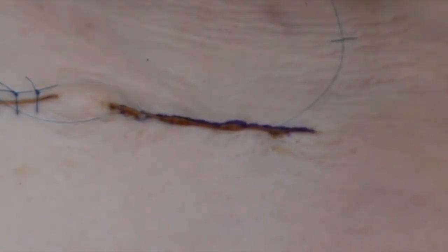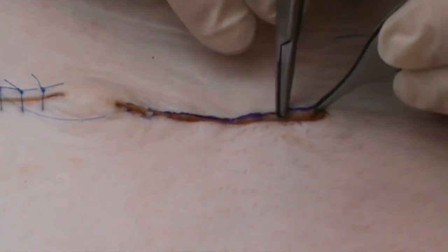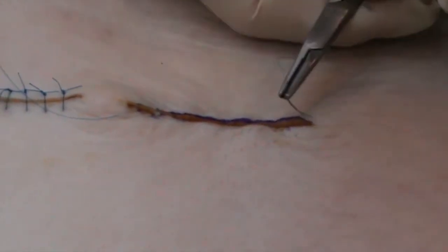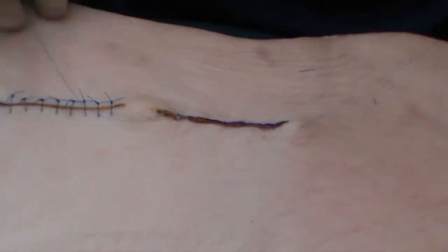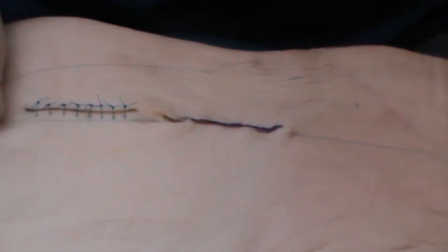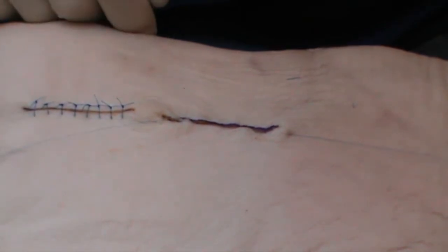This, however, is a non-absorbable suture and therefore the suture will need to be taken out at an appropriate interval — probably 10 to 14 days after insertion. The suture then can be taken out through the skin, and these ends tied together without tension. And you'll see that the wound itself has been brought together beautifully. So this is a traditional way of closing with non-absorbable material in a continuous subcuticular suture.